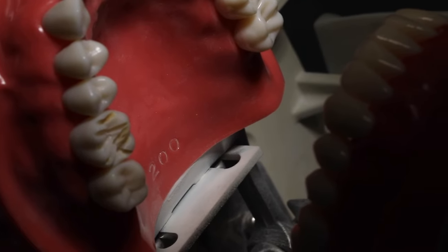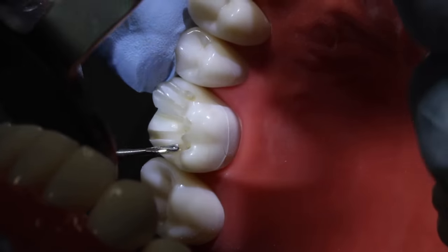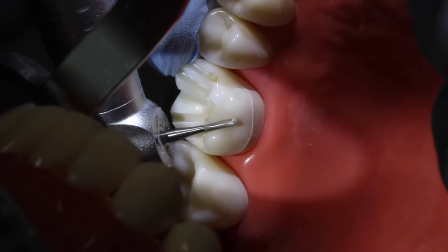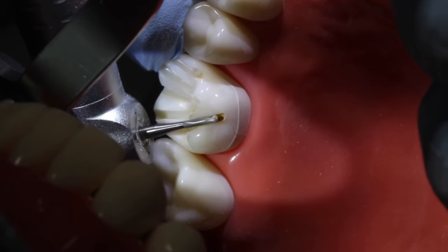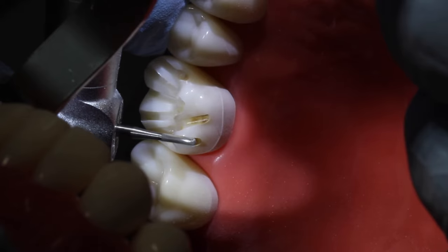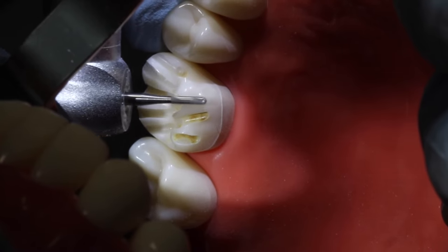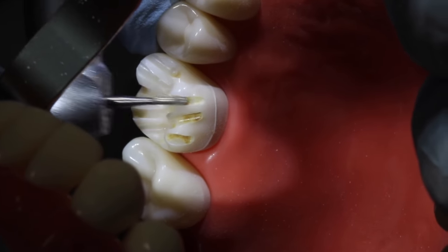Gotta lengthen our burr here a little bit. Okay, and again, we want to keep this direction from distal to mesial. I'm staying now in the lingual groove. And this is guide cuts for the functional cusp bevel. Do a guide cut for the distal lingual cusp, a very small cusp, and we'll do another guide cut. Maintaining the direction of the mesial lingual cusp.